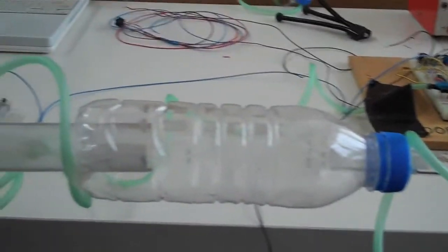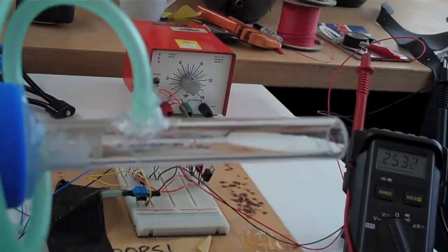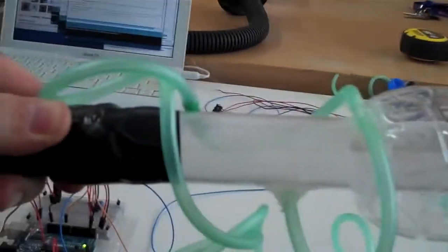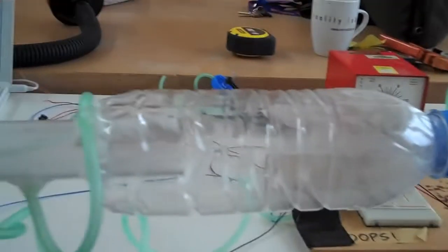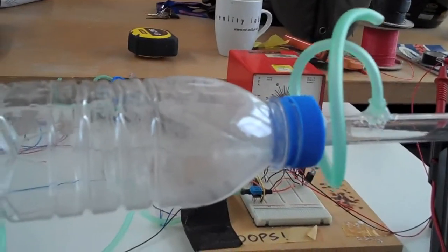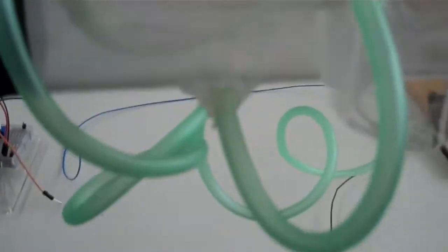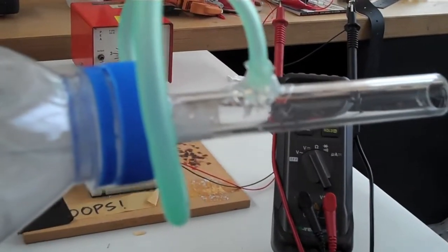And this is the kind of bong arrangement I've created, which uses two pipes of different diameters, with this central chamber, made using a plastic bottle, which is only there to smooth the airflow between these two pipes. It's standard practice in a wind tunnel to try and make the airflow laminar. So I'm taking static pressure off both tubes, and this is fed all the way down this static line into the differential pressure sensor.